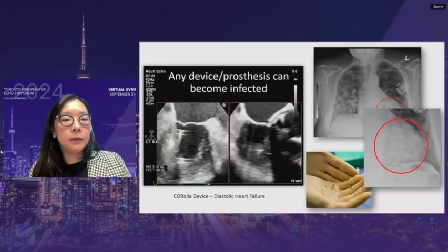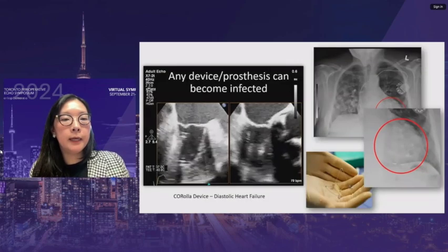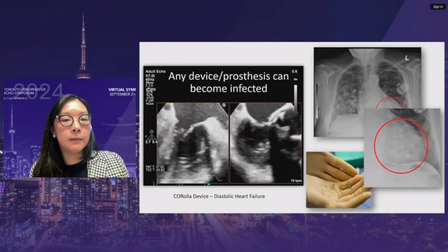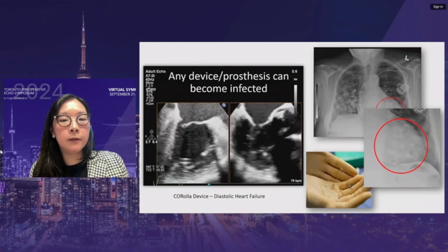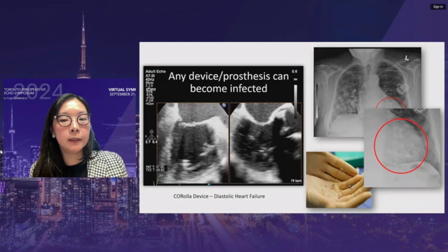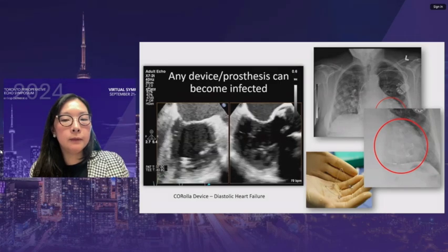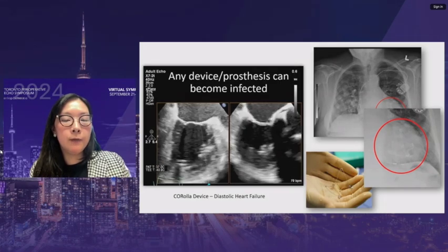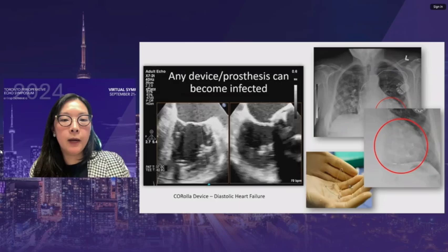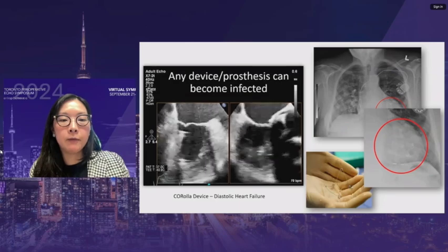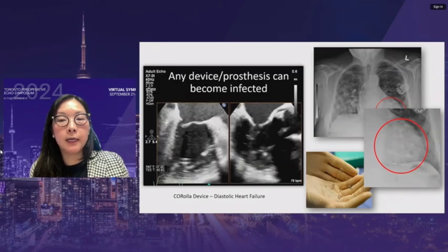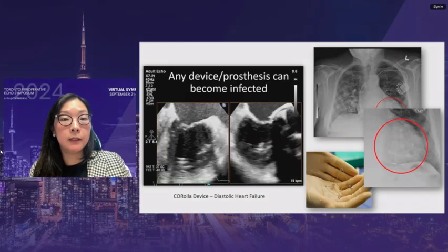Any device or prosthesis can become infected. In the LV cavity, a vegetation is seen on a Corolla device — a device implanted to help with diastolic heart failure. The patient presented with fevers, a vegetation was clearly identified on echo, and the device had to be removed in the operating room.